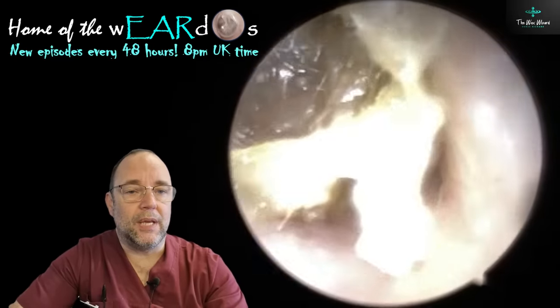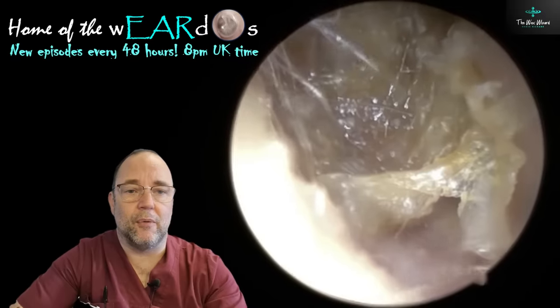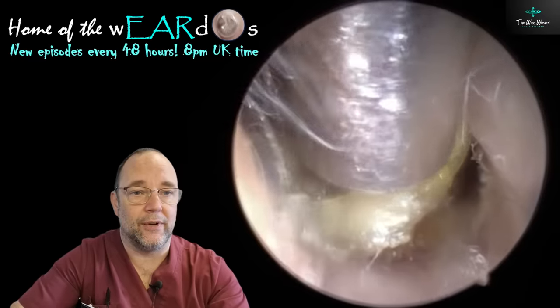The second one wasn't quite as deep. When I looked at it first, I thought I'll be here all day with the fine end tube in this, so I decided to get the full-size tube in there. And you can just see it fills up pretty much the entire ear canal, so the visibility is slightly affected by that, but it would have taken forever otherwise.